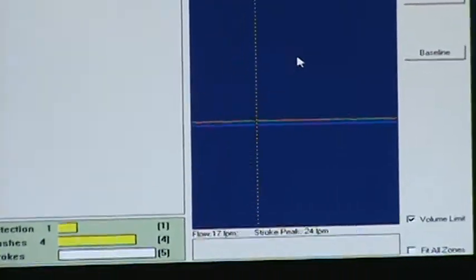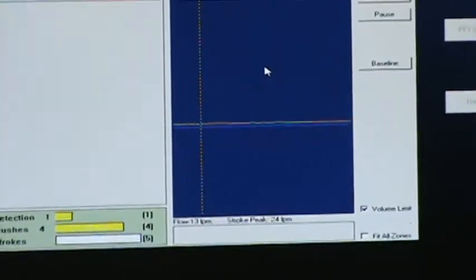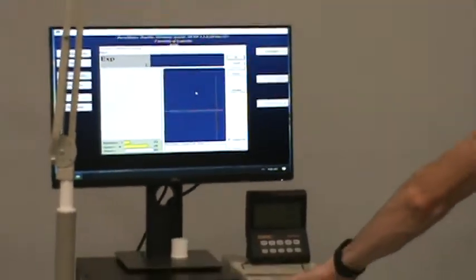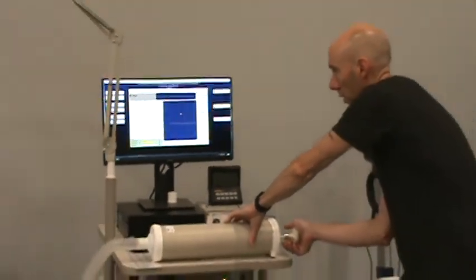And this is simulating the rate of flow that will be occurring during the test. Because our subject is resting, there will not be large volumes of air moving through the cart.